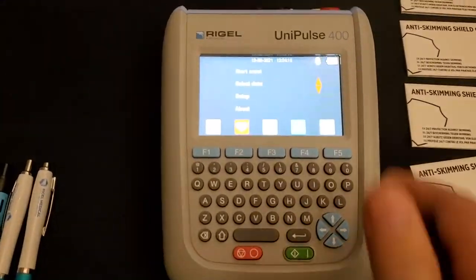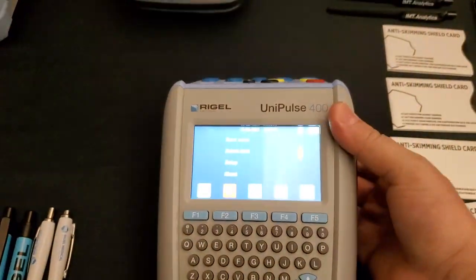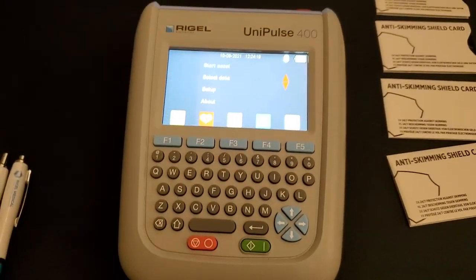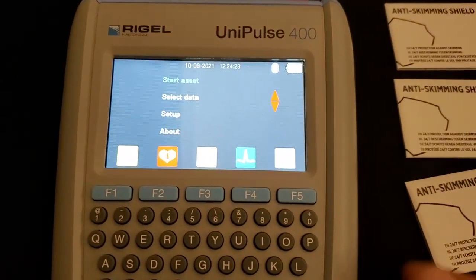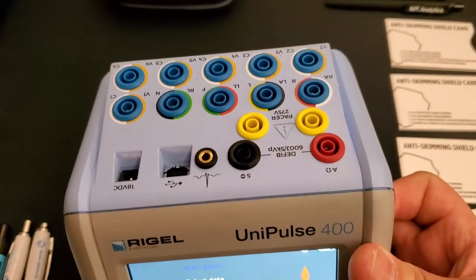Hey guys, I found a device that I hadn't had the time to capture and I've been playing around with it here just to see how intuitive it is to pick it up, never seen it before, and start running with it.